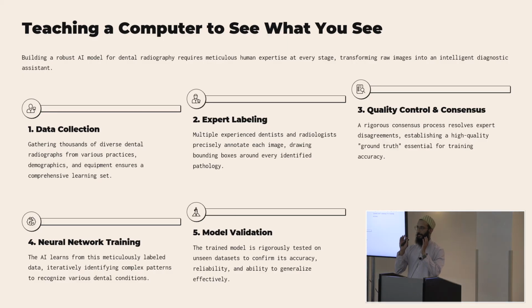And that 10% that's used for evaluation is generally put completely to the side, and that's the final test before a model can be put in front of people. Nobody can touch them, nobody can look at them, they're just to evaluate how your model is doing. That's why you can keep track over time, and as you train more and more models, you make sure that the model doesn't get worse over time. So you train it, you test it against your eval set.